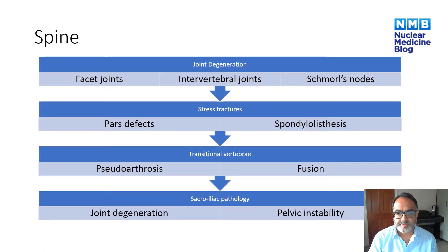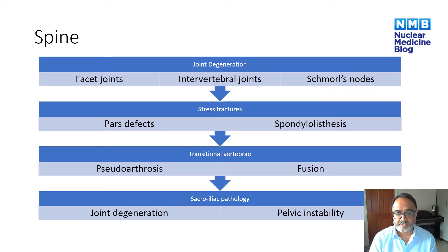When we image the spine with SPECT CT, we can look at multiple different pathologies at the same time. We can look at joint degeneration, whether that's in the facet joints or the intervertebral joints. We can identify Schmorl's nodes, look for stress fractures such as pars defects and spondylolisthesis. We can assess for transitional vertebrae, which can result in pseudoarthrosis or can be partially fused, and we can also assess the sacroiliac joints for joint degeneration and causes of pelvic instability.